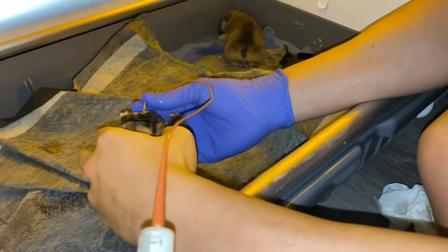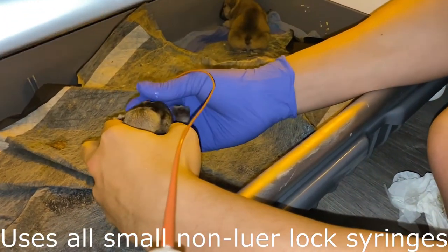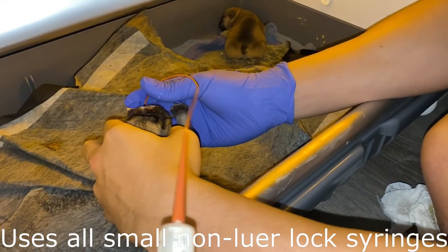If you inject inside the lungs you can drown the puppy, possibly kill it, or cause pneumonia — infected lungs. So if you do it wrong, you can possibly kill the puppy. Size eight is pretty good for beginners. I also recommend size five — I personally use size five for puppies that are newborns to about one week old, and then after that I switch to a size eight.